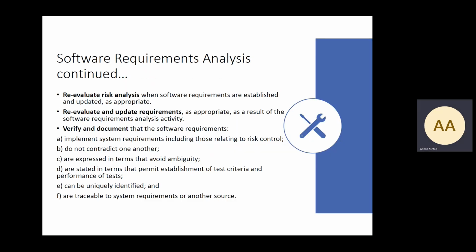So, software requirements analysis continued. Reevaluate risk analysis when software requirements are established, and update as appropriate. You're going to see risk analysis mentioned throughout this slide deck, because it is imperative that risk is inherently embedded into all of the activities within software development. Then reevaluate and update requirements as appropriate as a result of the software requirements analysis activity.